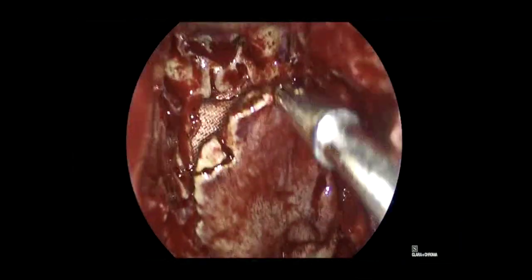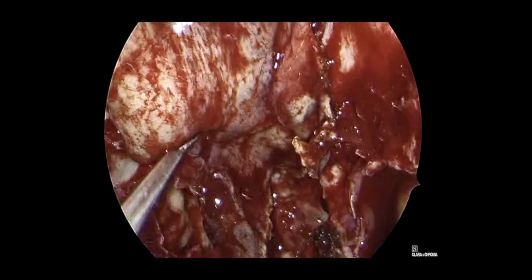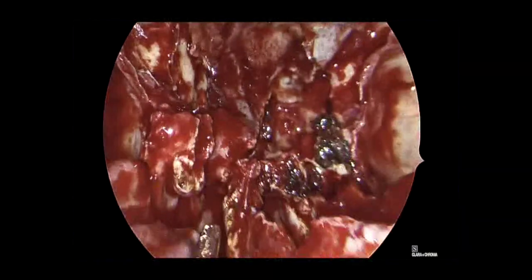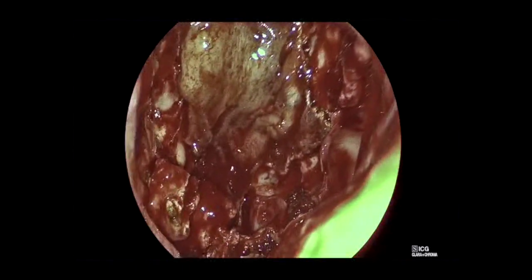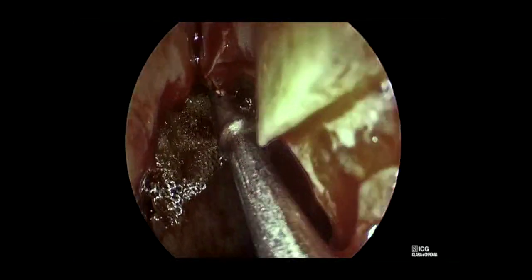Now we pull up the nasal septal flap anteriorly — it can reach all the way into the posterior table of the frontal sinus. That extended portion is very nice to cover the defect from orbit to orbit. Unfurling all the edges and ensuring nice contact all the way around. This was a bit of a narrower pedicle due to tumor involvement, but an ICG run demonstrates really nice vascularity of the flap all the way to the end of it. We'll then place some Surgicel as a picture frame around the edges, tuck in some gel foam for nice apposition along the skull base towards the planum, and then do some additional packing with dural sealant.